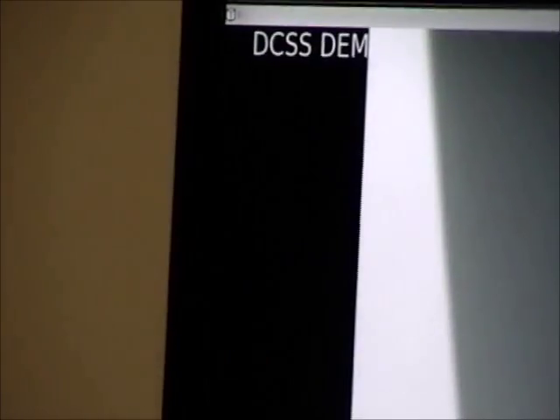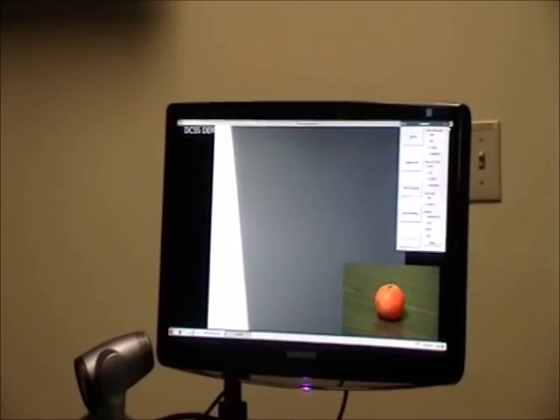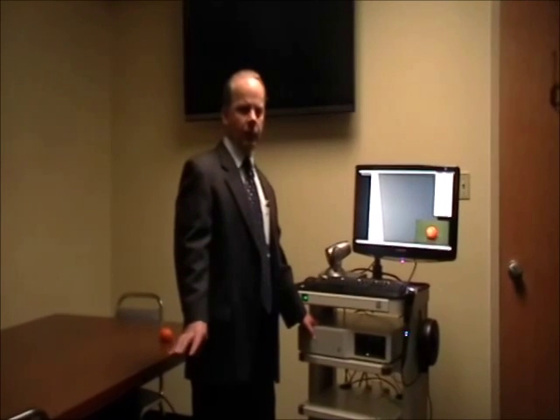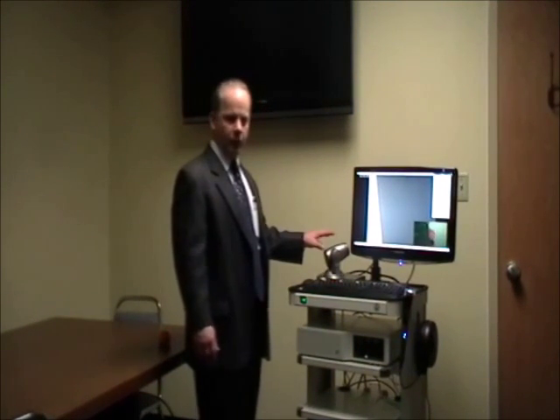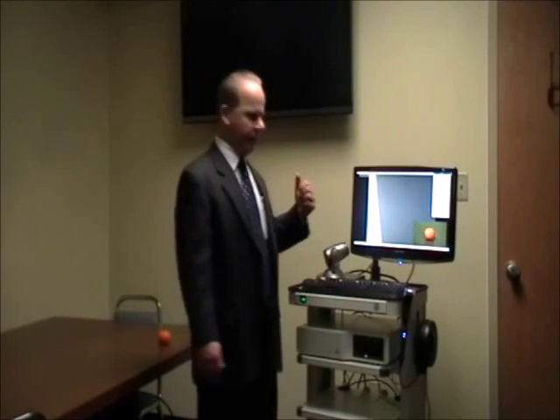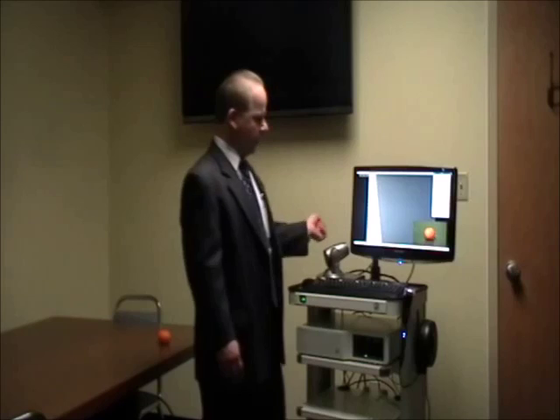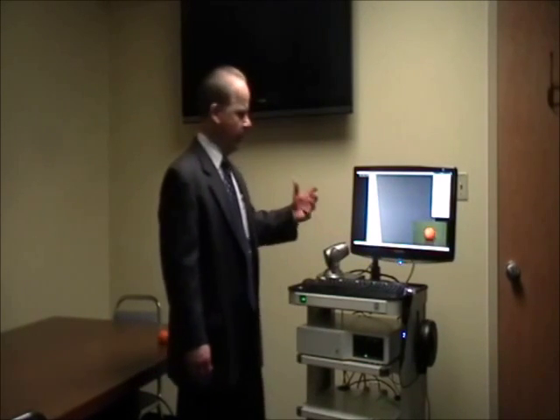And another thing we can do is this system is also set up via a software package to do live video streaming of anything that we're seeing in this room. So it could be the room camera focused on the caregiver or the patient, and moving between them even, along with the high detail image from the handheld camera at the same time.